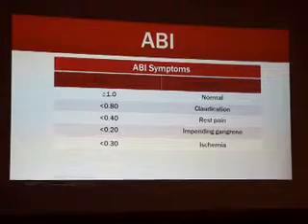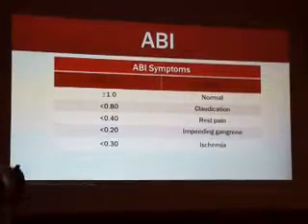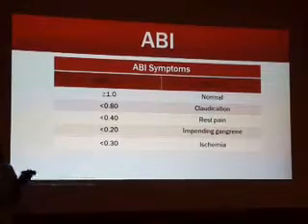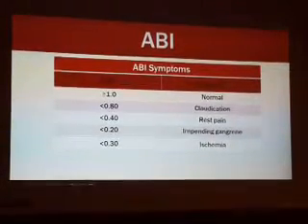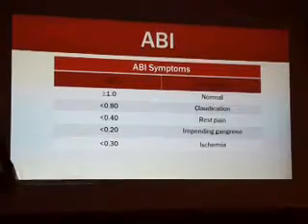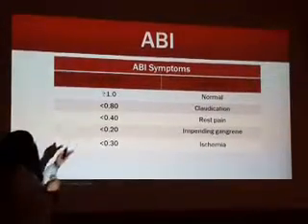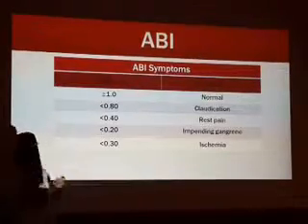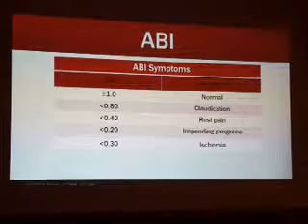Symptoms: if a patient comes with gangrene, you take the patient's history. What do they have? He has an ischemic leg. He cannot move. He has high blood pressure. He has a diabetic foot. So your conclusion is that you will expect maybe category 4 to 5, and the ABI should be less than 0.4, depending on the patient history. This is like a respected view before you start your examination.